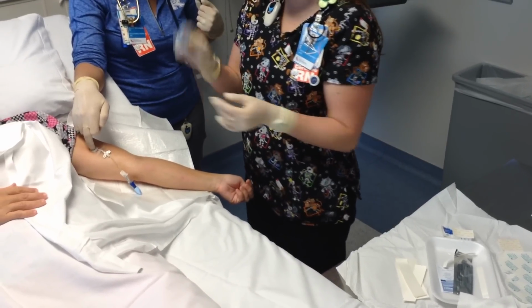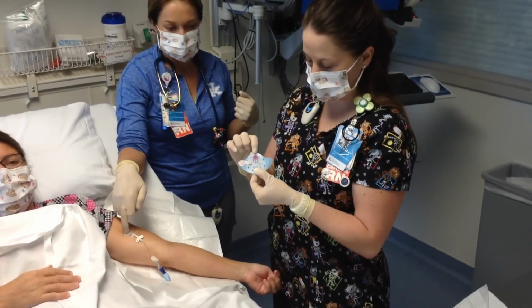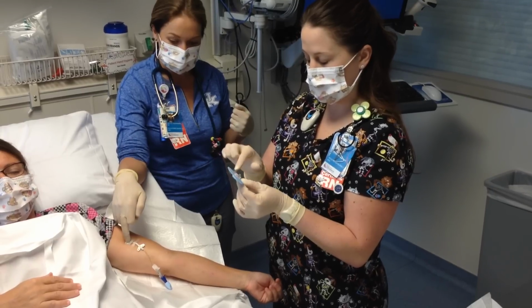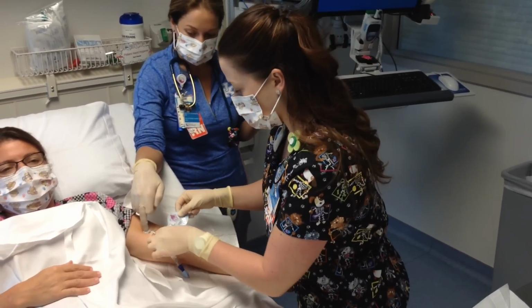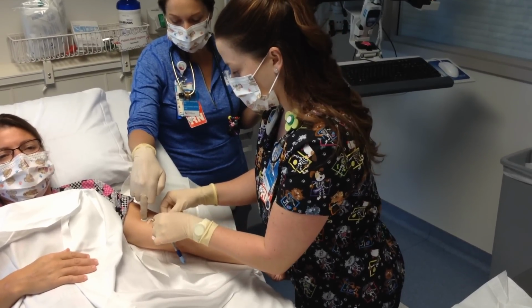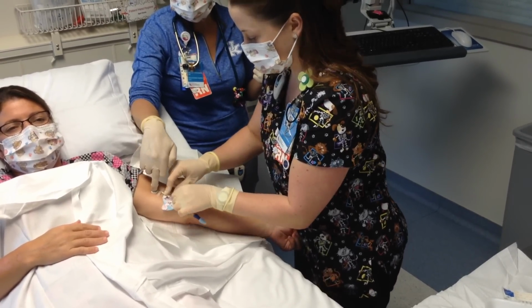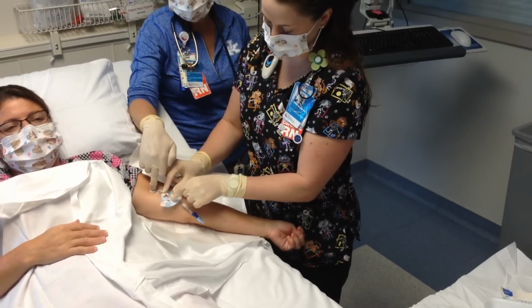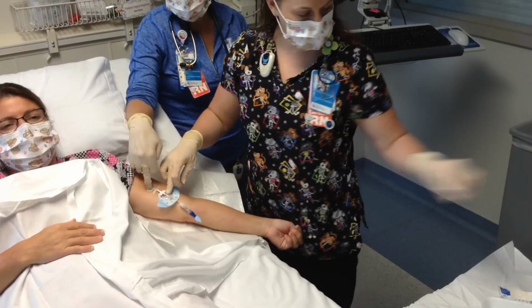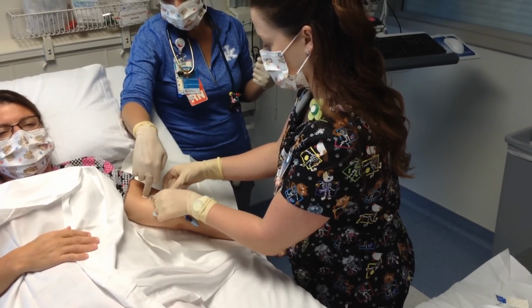So for your 3M, you'll first apply your securement device. On your securement device, it shows purple wings. That is where the wings of your catheter go. The rounded part is what goes towards your insertion site. So I've cleaned this area of my catheter so I can now touch it. My wings will go right where my purple wings are. My catheter will hook into my securement device. My top piece goes over to secure. Then I want to make sure it's on the skin properly where my catheter is not kinked. So right there looks good.